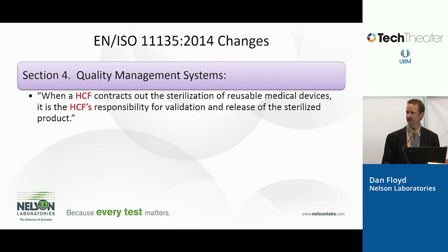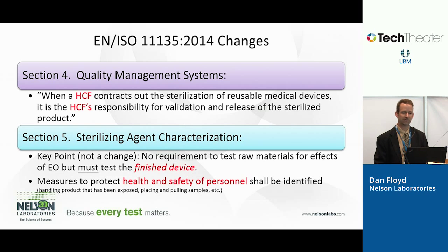Again, healthcare facilities, that's what HCF is, that's been put in there. So they put the onus for validation and release on the healthcare facilities' responsibility. Even if they contract that out to a third-party reprocessor, there's companies that some hospitals will send their devices to get reprocessed if the hospital doesn't do it. But this is basically saying it's still the hospital's responsibility for those devices.